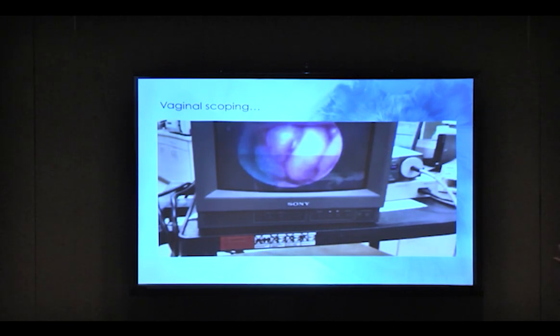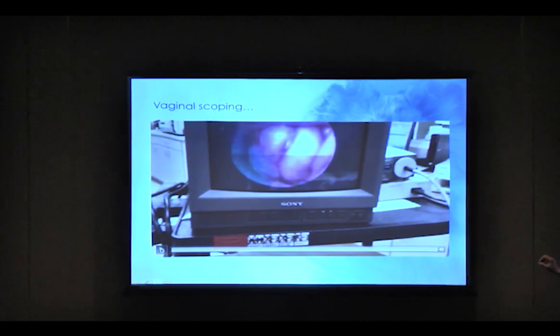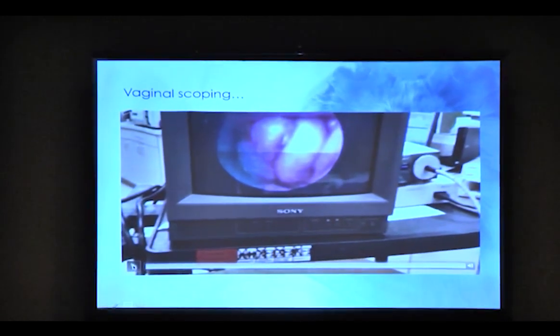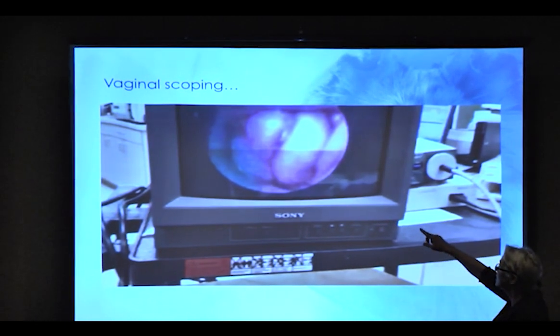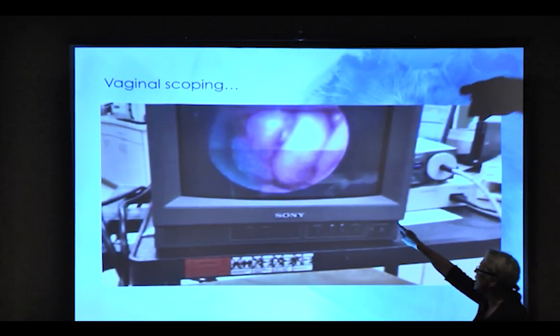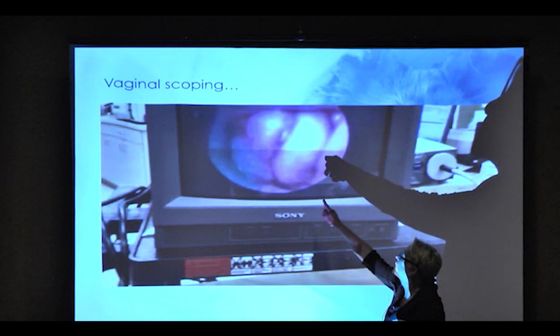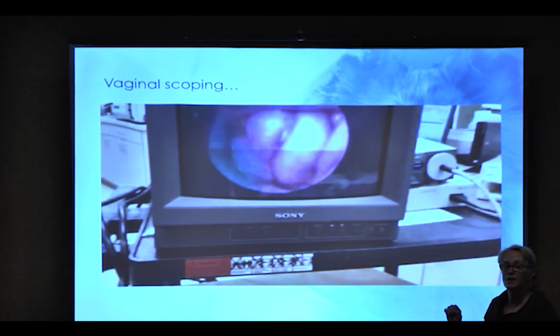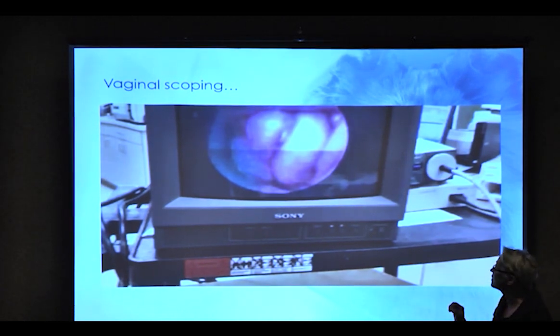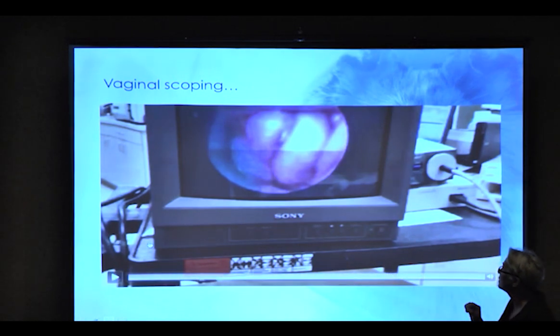Okay, now before we get this started, this is a scoping, and I'm going to have you stop it at a certain point. We're looking through that scope, and this is our TV monitor, and this is what we see. These are vaginal folds. This is a bitch that is ready to be bred. If she's not ready to be bred, you see a lot of blood in there. Or if you've been traumatic, you're going to see a lot of blood. Okay, go ahead and turn it on.